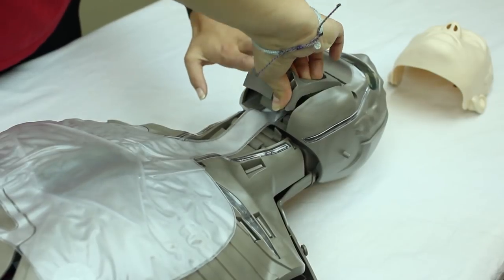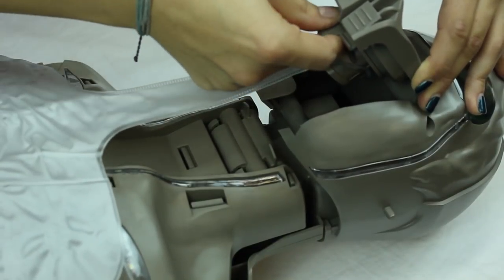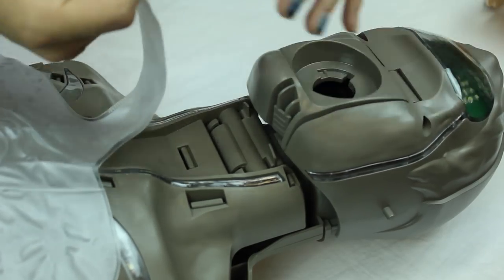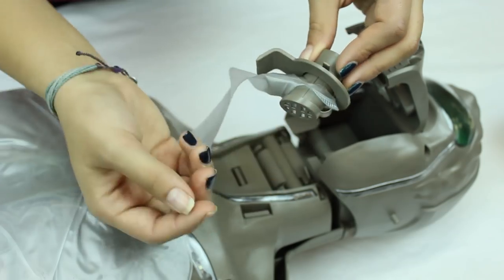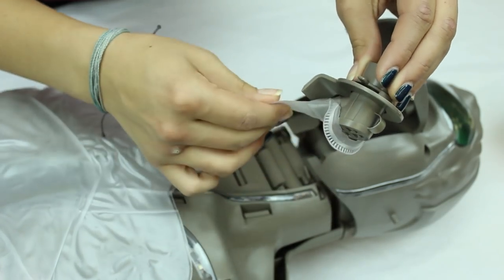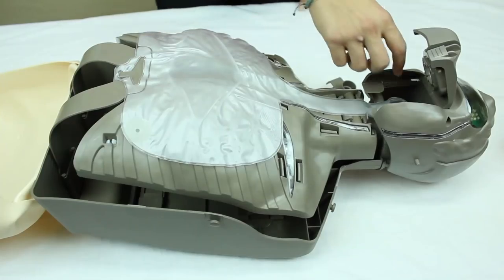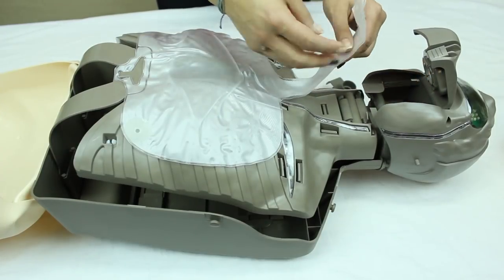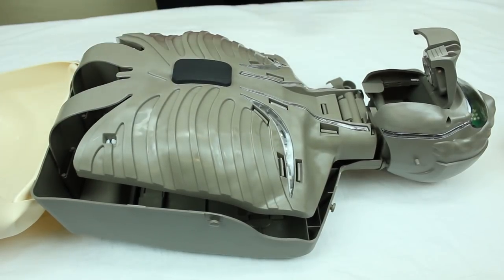Unclip the jaw area. Grab the handle and turn it to the left. Then grab the top of the lung bag and pull it off. Once you get the lung bag out, pull it off the mouthpiece and throw it away.